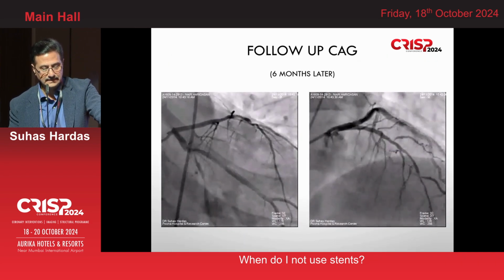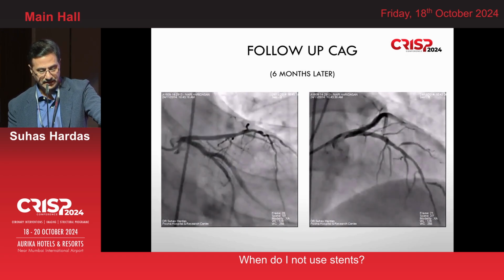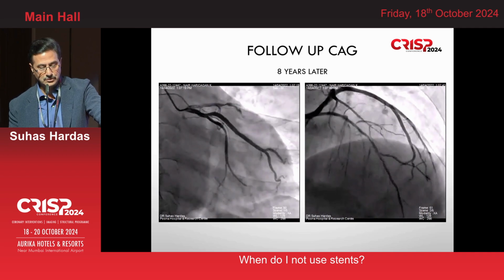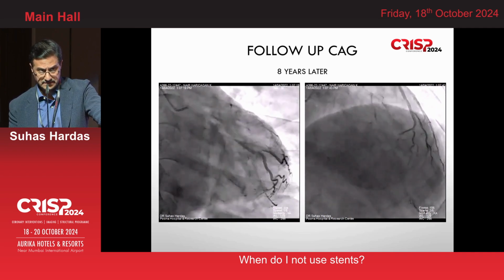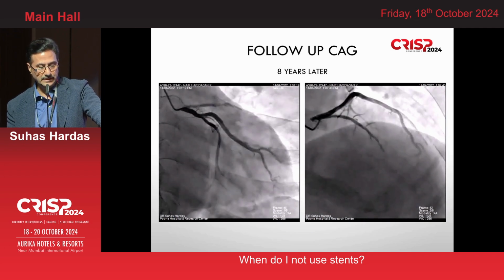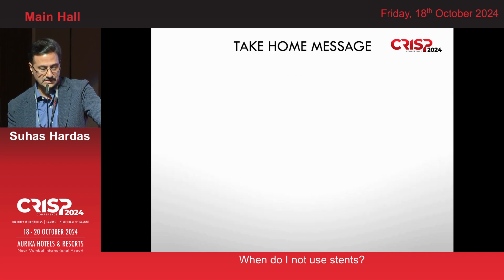6 months later, the stent is holding on well. The distal LAD disease is also holding fairly well. And now, 8 years later, that is in 2022, the stent is holding well. The distal LAD is also holding extremely well. He has had a coronary angiogram recently, which is once again showing good results.